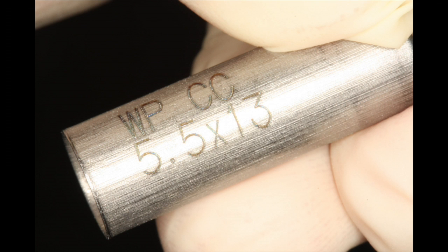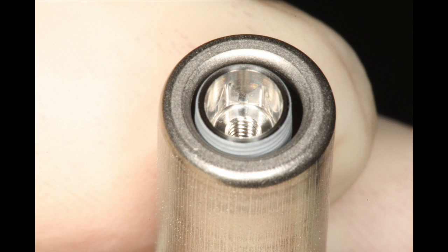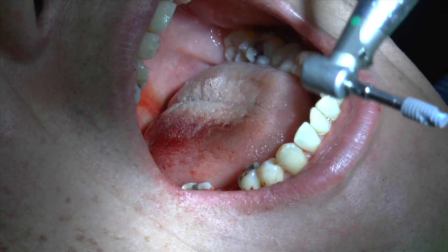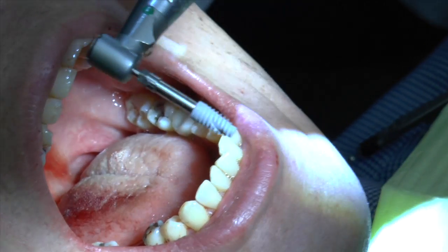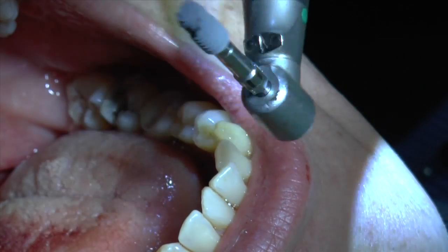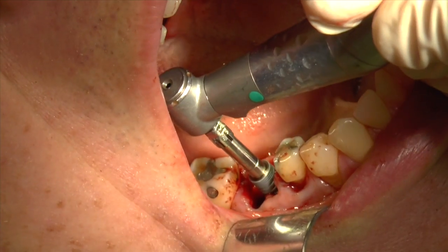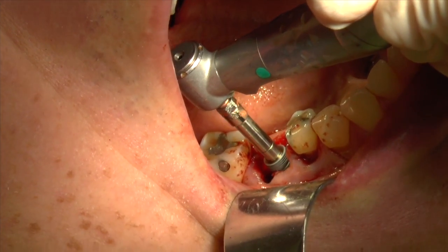We're using the wide platform conical connection 5.5 x 13mm implant. It has a nice generous thread, platform shift — the smooth top — and then the conical connection with the hex inside, which has been shown to be successful at maintaining bone in a very fantastic manner. Taking the implant out to have a look: it has that aggressive thread pattern with a large pitch, with actually two threads, one on either side of the implant, which push against each other. Going from a very pointy thread to a more square thread at the top of the implant, we're able to get fantastic stability, which is so necessary for immediate placement.